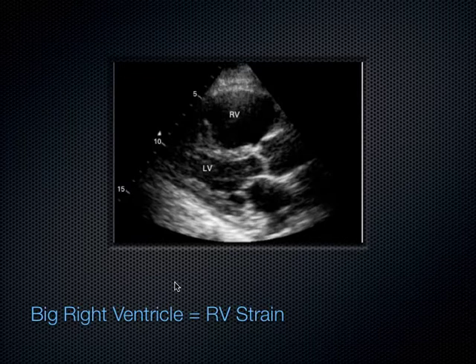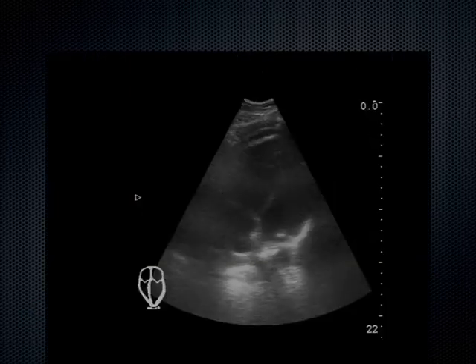But with massive pulmonary embolism causing shock, that right ventricle is trying to pump against that clot in the pulmonary artery, so it's got nowhere to go. The blood's got nowhere to go, so the RV is getting bigger and bigger. It completely makes sense from a logical standpoint, which is what I love about this pulmonary embolism stuff.